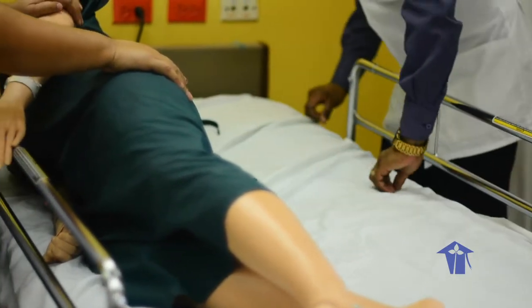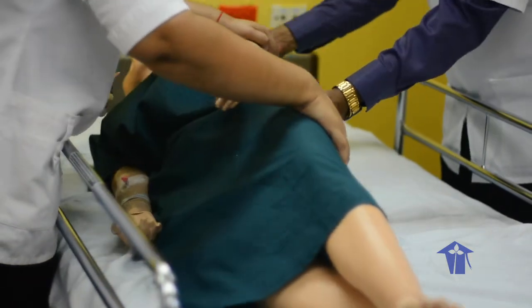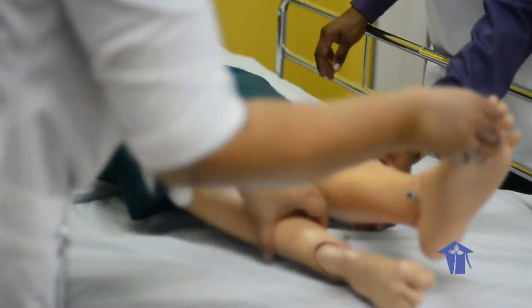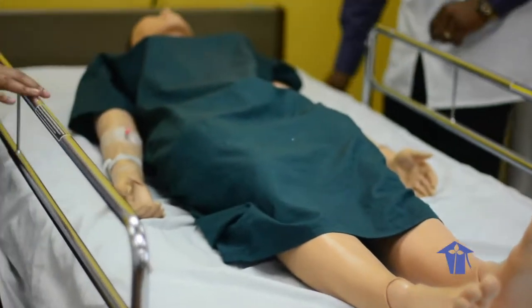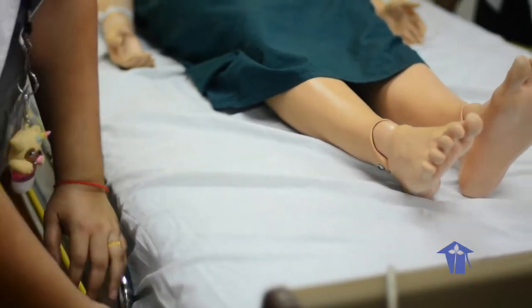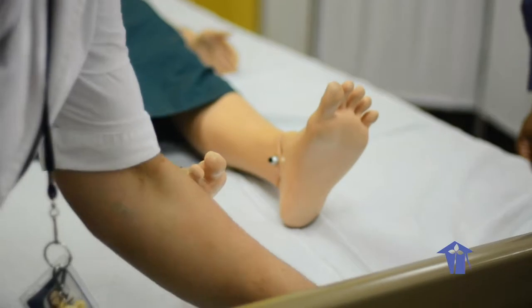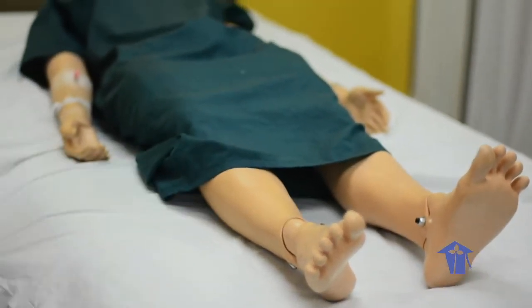Good. So I'm going to roll you back again, okay, Mrs. J? Ready? Brace, slide. Are you okay? Yes, I am. Good. So at this time now is where we will fix our sheets together, because our patient is comfortable at this point. If you notice, she is covered, nothing is showing, all right?